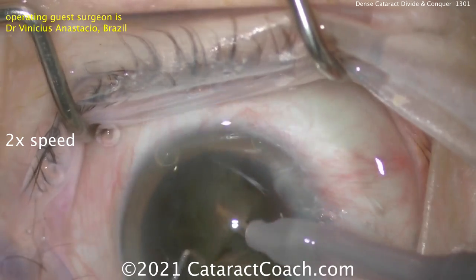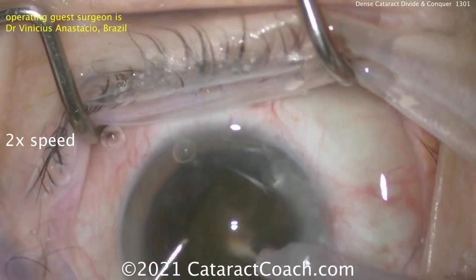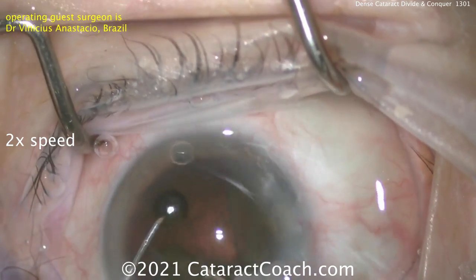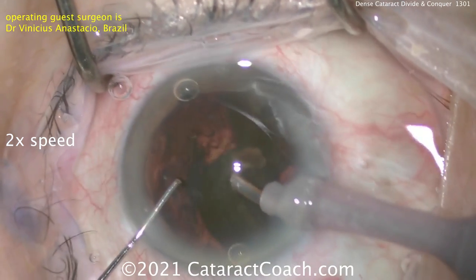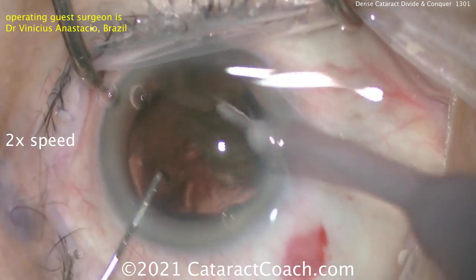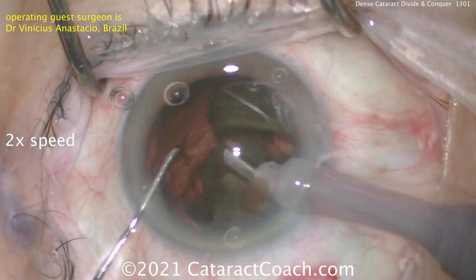Now a little bit of a chop — kind of a hybrid, mostly divide and conquer, kind of stop-and-chop, a little bit of everything. I like this technique. Breaking the nucleus up into smaller pieces that can be emulsified pretty well. He's keeping that phaco probe beautifully centered in the incision. The pivoting here is just on point, done very, very well.